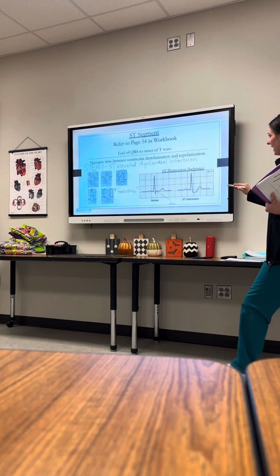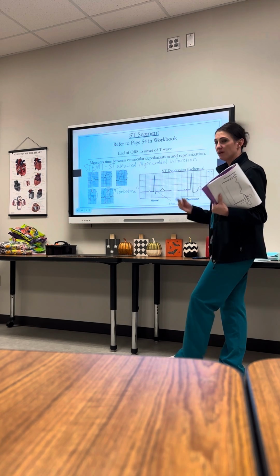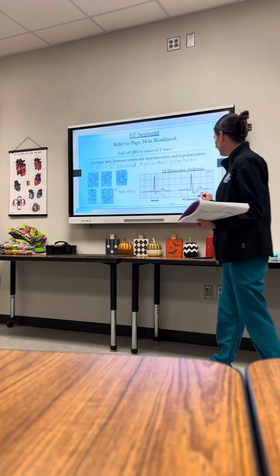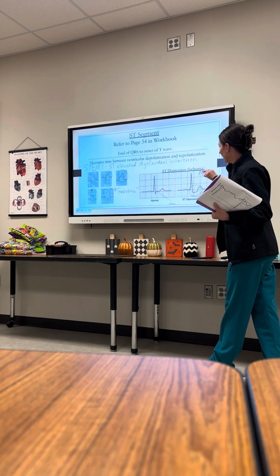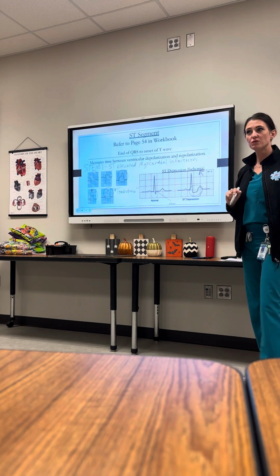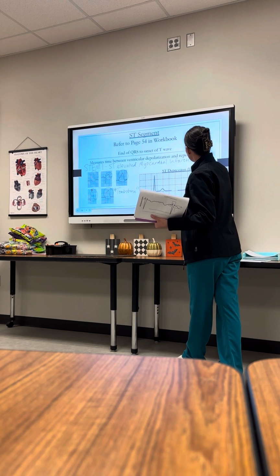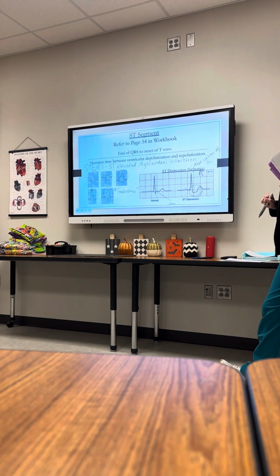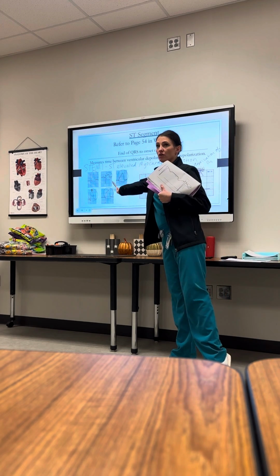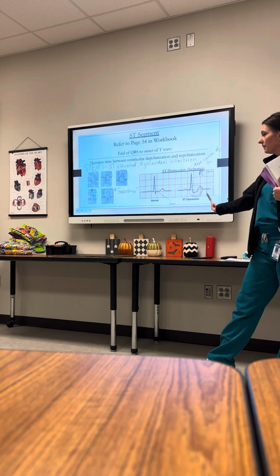Okay, let's talk about ST depression. If this ST segment goes below the isoelectric line, I'm going to call it ST depression, and it is going to be indicating ischemia. What did we say ischemia was? Deprivation of oxygen. Write it again, deprivation of O2. So STEMI, myocardial infarction. ST depression, ischemia.